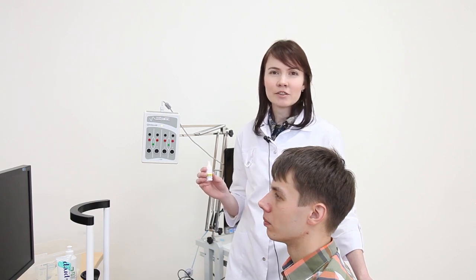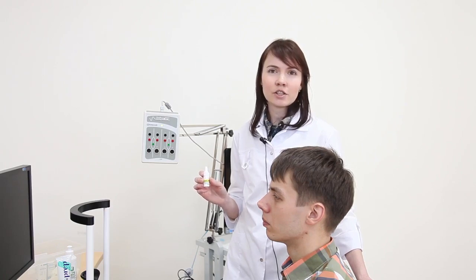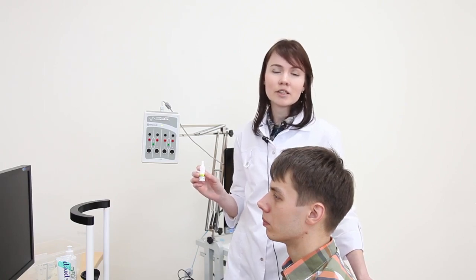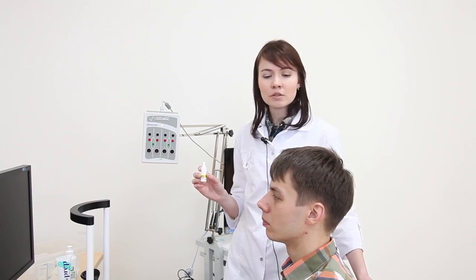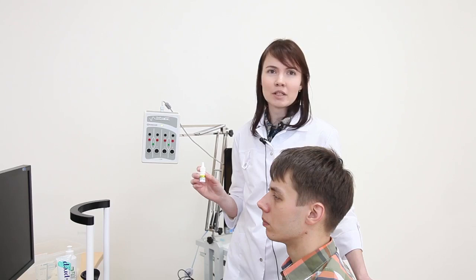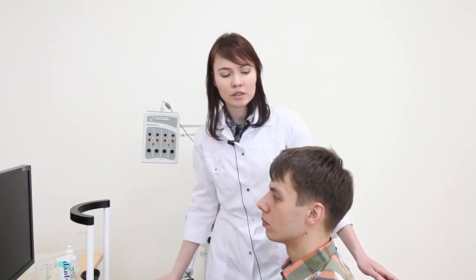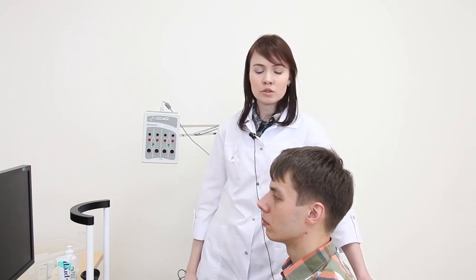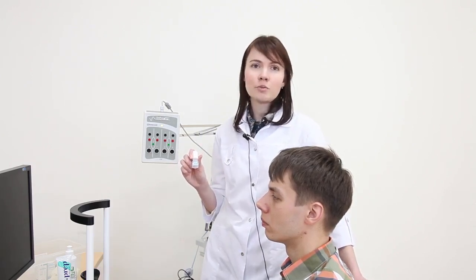To obtain a high-quality signal recorded in accordance with ISCEV recommendations, we should prepare a patient in a certain way. The patient's pupils should be fully dilated. To do this, use the mydriatic eye drops. The short-acting ones are preferable. It should be applied 10-15 minutes before the test starts. Then, before the electrode placement, we should instill the topical anesthetic drops to minimize the pain occurring at corneal electrode fixation.